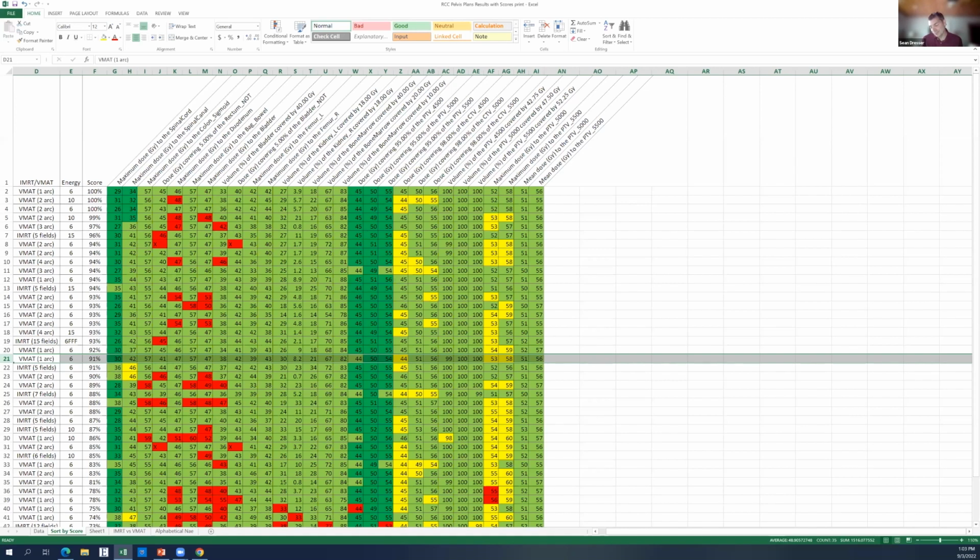The thing is about fluence. I wanted to ask how the fluence works during the flash margins, because I know we use it for breast cases. I'm a Monaco planner, and when I put an external structure like a bolus structure and recalculated my plan, which was optimized with flash margin, it gave hotspots on that bolus. The fluence was really high on that part. Where's the flash margin part? Okay, so it's trying to force the dose, make sure you're getting full dose outside onto the edge.